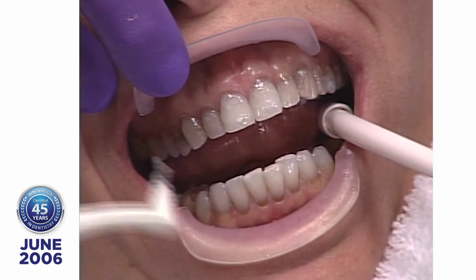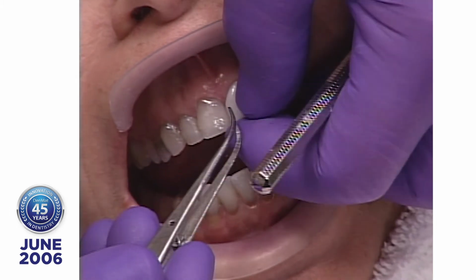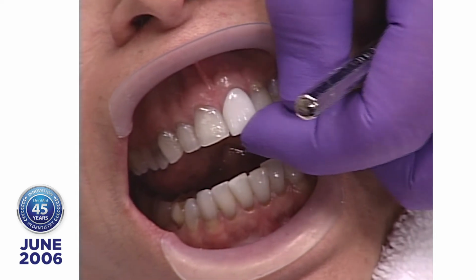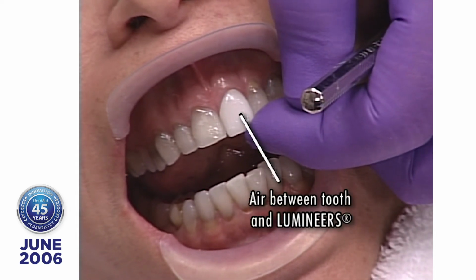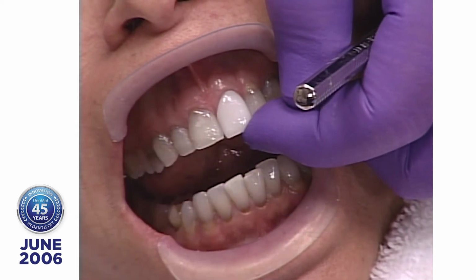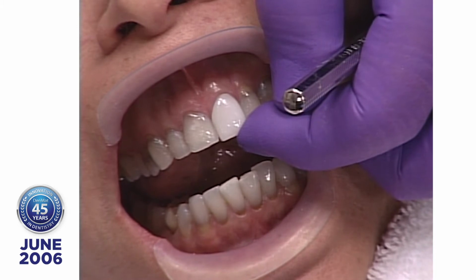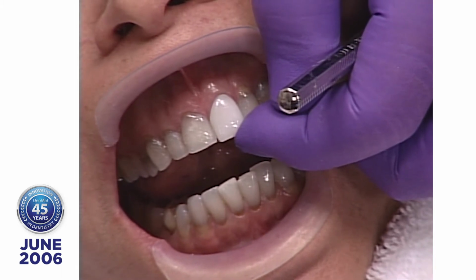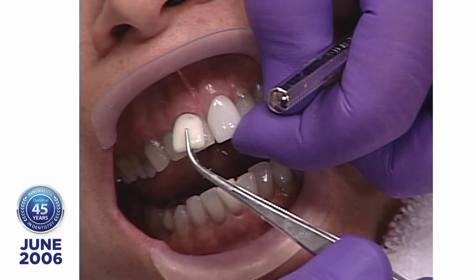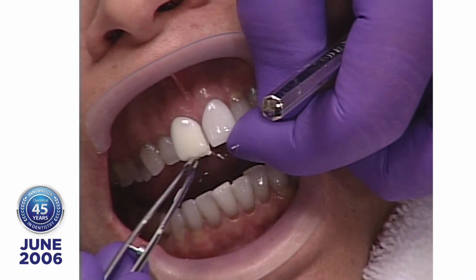So think about it. Right now we've applied 2 solutions to the surface of the teeth, and we're going to select the shade. We're going to put one on without any try-in paste, and you're going to get 1 shade. Now what you're looking at is not the color of what the tooth will look like when you bond it. The reason is there's air between the etched surface of the porcelain and the tooth. And once the light hits air, it stops going forward and reflects back. So what you're going to get is the color of the etched surface of the tooth being reflected back. And then we're going to put one on that we think would be the right shade. And you'll see that they're different.